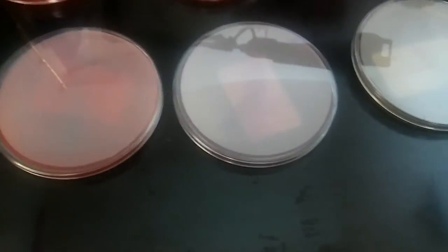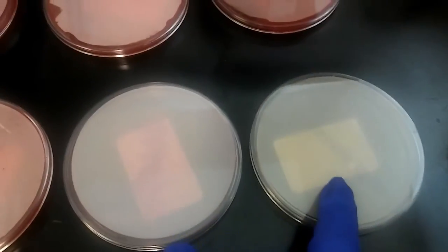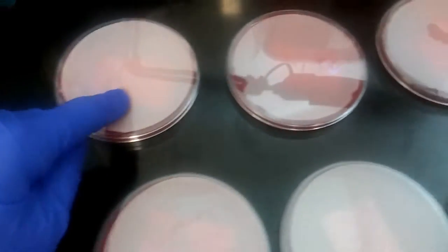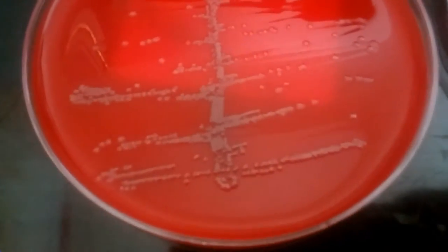So here we have a urine culture, a blood plate, a MAC plate, and a BEA plate, and the rest of these are strep cultures, all on blood agars. So this is what the first urine culture looks like on the blood agar. As you can see, there is growth.